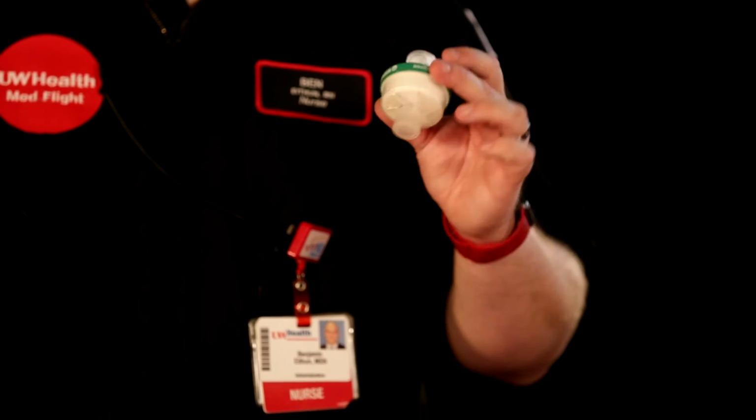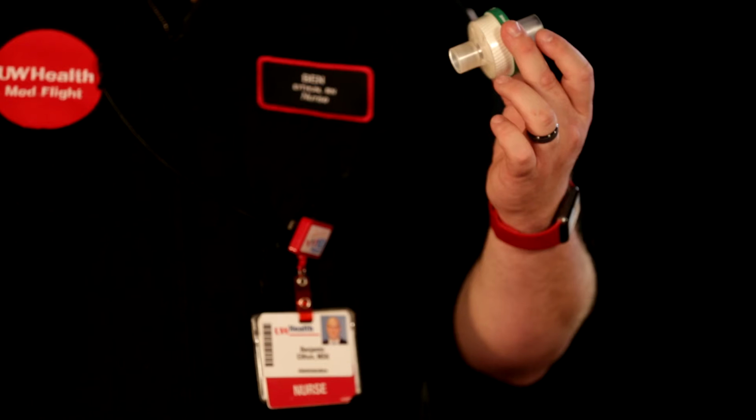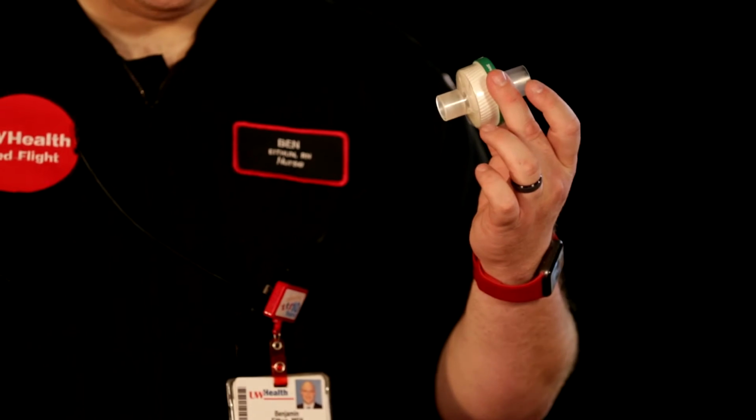For example, if I'm going to bag mask a child, that's going to cause their airway mucosa to spread whatever pathogens they have in there. So anytime you have to bag a child, you want to make sure you have a filter, if at all possible.